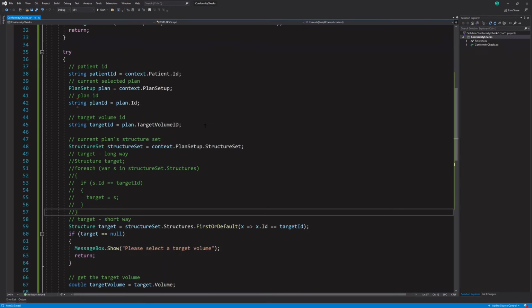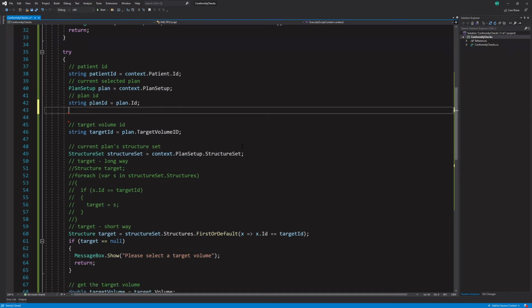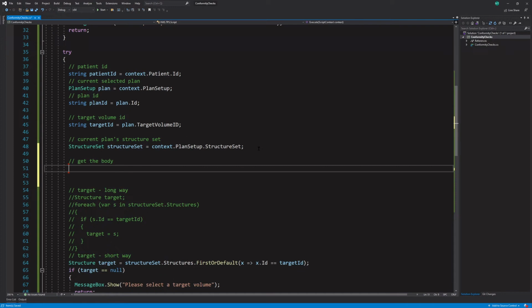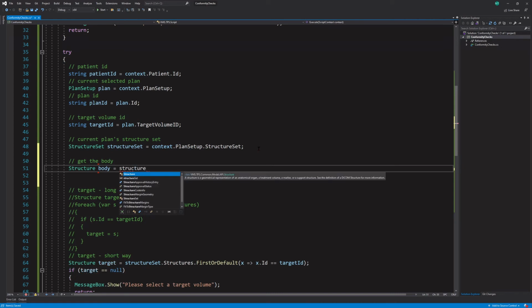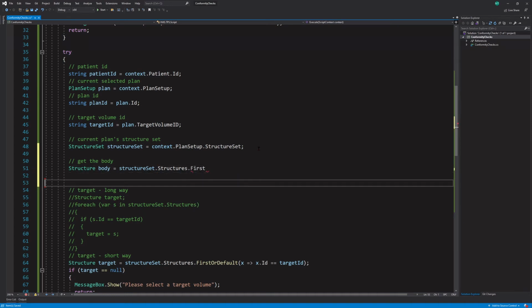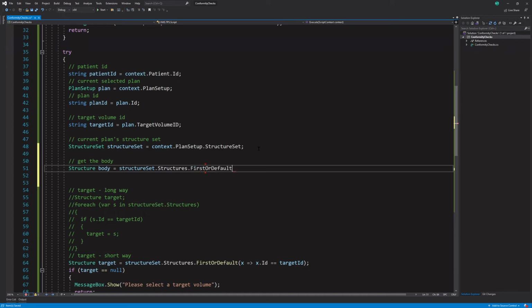So we need to, let's get the body. When do we, okay, so we did the structure set here. So let's get the body. And in this case, I think it's named external. But so we'll say structure body equals structure set dot structure set dot, oh, I can't spell right now. Structure set dot structures dot first, whoops, or default, and then we're going to do the same thing that we did below.